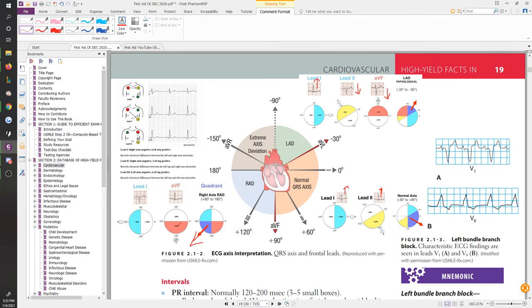Your actual correct AVF formation would be such that when you do an overlap with these two guys, your blue is supposed to be like this. Remember, the normal blue is this one, okay? They haven't given you a normal AVF image here, but the normal AVF image would be in such a way that it would be something like this, okay? So that when you overlap the two, you get this overlapped area right here that I'm coloring in, which is very similar to this. Okay, that's how it's supposed to be.